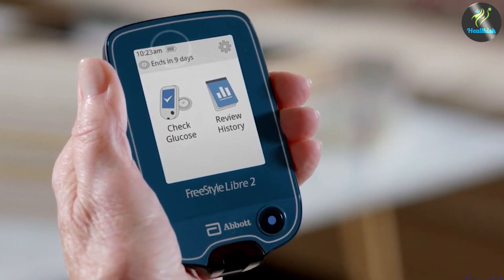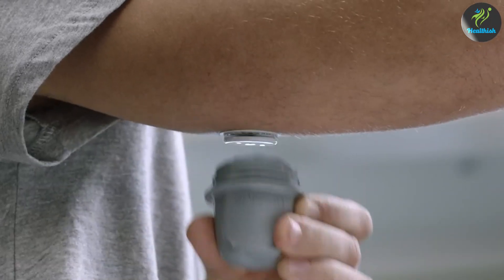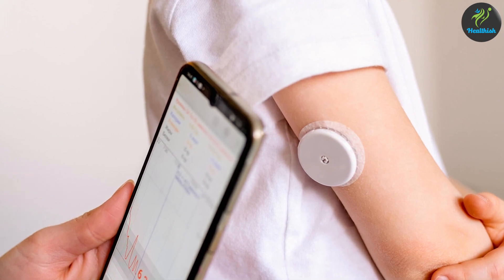The sensor is a continuous glucose monitoring system designed for people with diabetes. The system consists of a small, round sensor that is worn on the back of the upper arm and a handheld reader or smartphone app that displays glucose levels in real time.